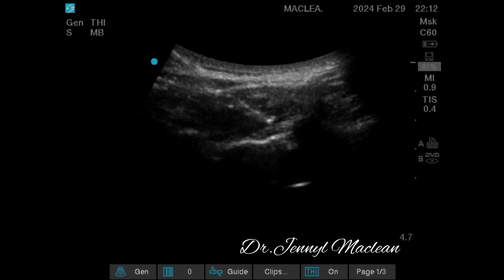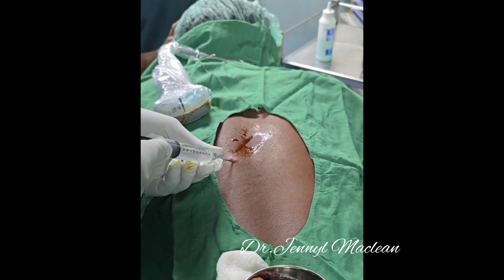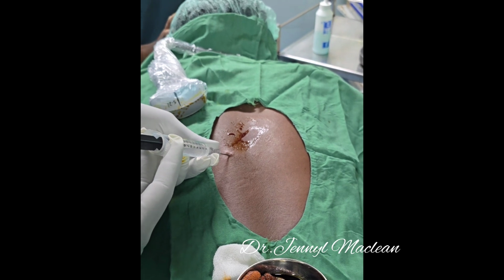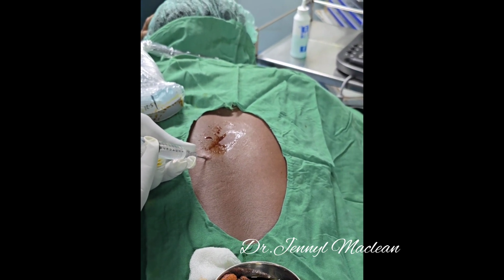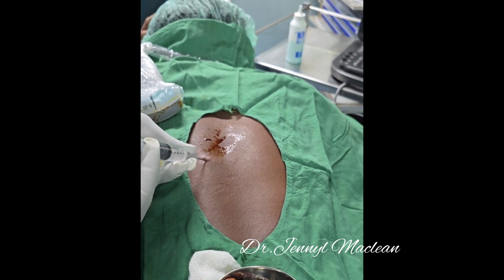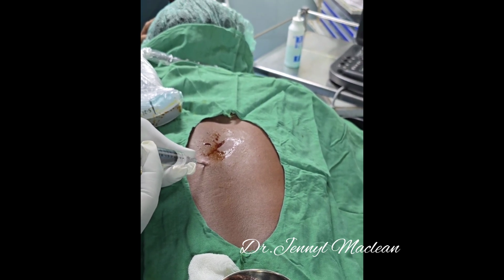And then with the successful placement, you can give a single shot of 10 ml for any segmental thoracic epidural, and you can make the patient walk. I made this patient walk after doing an open appendicectomy.